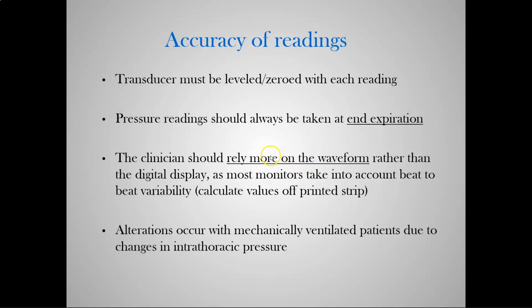That's 100% true, because if you have a digital display that is giving you a number, for example, like I'm getting a wedge, my wedge says 1 or 2. Well, I know that's incredibly low, and I may have a very serious problem. But if I look up at my waveform and it's dampened or flattened out and doesn't quite look correct, then that indicates to me that I probably don't have an accurate representation of what the pressure actually is. In that case, it's not your responsibility to advance, to move, to manipulate.